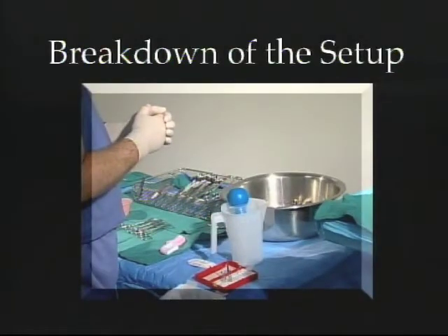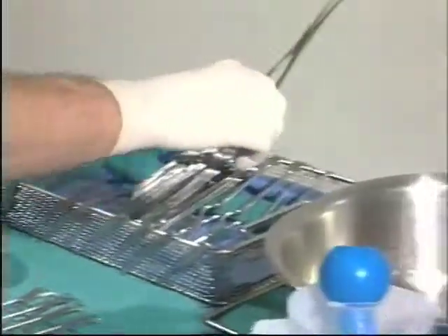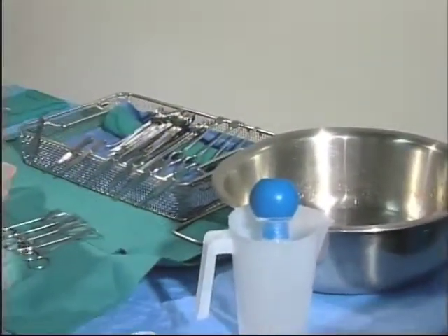Remove any sharps from the isolation basin and the Mayo stand and place them on the back table with the other sharps. Remove the instruments from the isolation basin and the Mayo stand, open the ratchets or disassemble each instrument as needed, and place them in the basin of water.